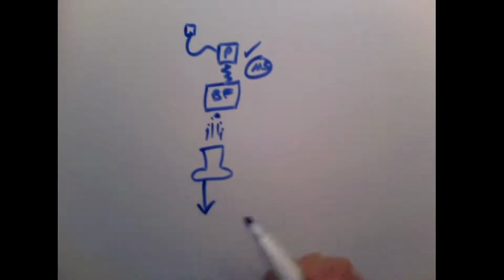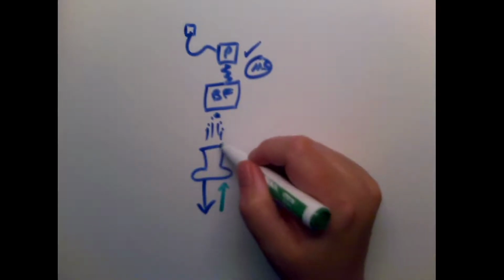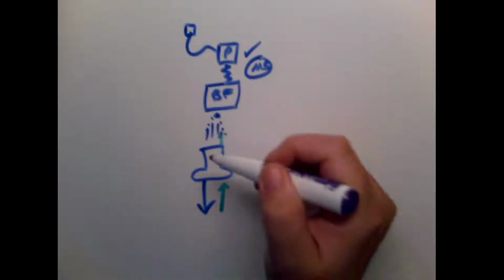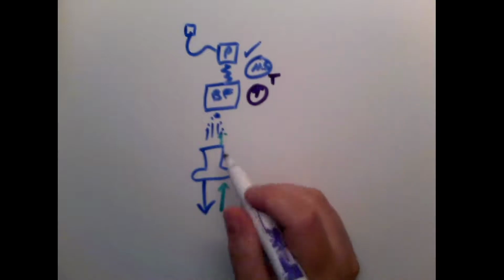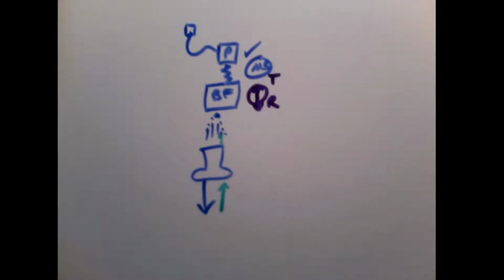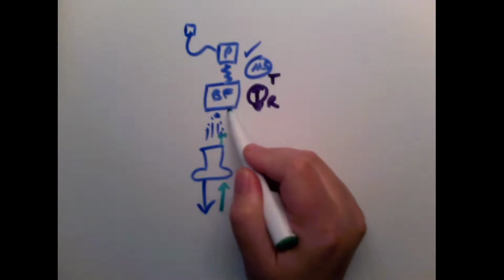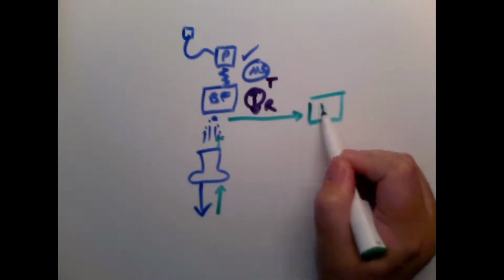The transducer then sends out the sound energy, and then it's going to get echoes back. Remember, those echoes coming back are very weak. I should say, as all of this is on, the switch is up to transmit. Now we've transmitted, echoes are coming back, and the switch moves down to receive mode. Our echoes are coming back, and remember, they're really weak voltages. The beamformer does a little bit of processing for them, but it mostly all gets sent over to the receiver.